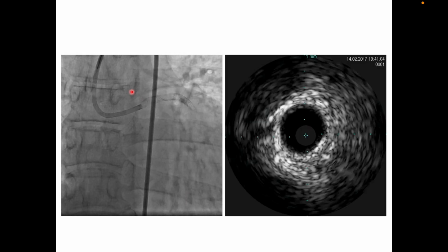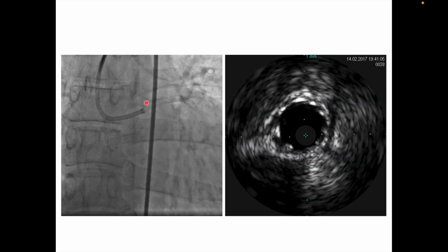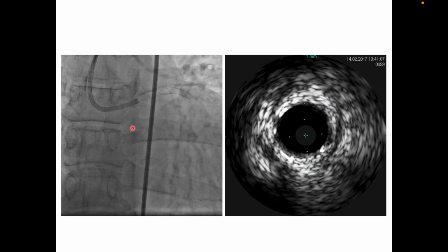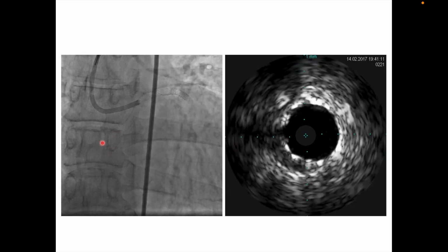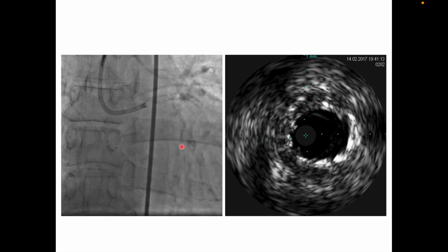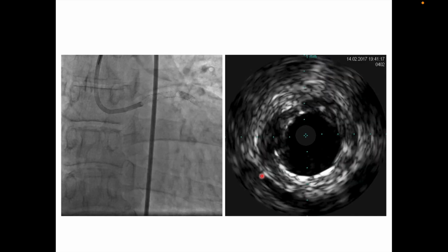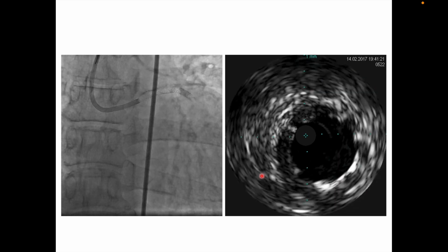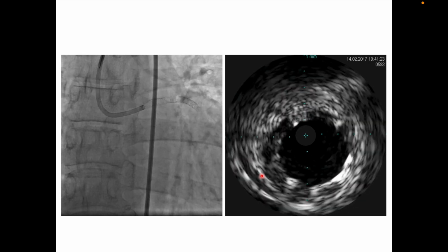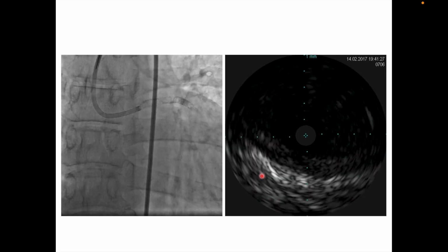But you can see here that the unraveled BMW wire is jailed behind the stent, and some of it is also hanging in the ascending aorta. So this patient had to be kept on dual antiplatelet therapy and probably will continue lifelong dual antiplatelet therapy. This case was done I think almost 4 years ago, but he's still doing well and he's still asymptomatic.